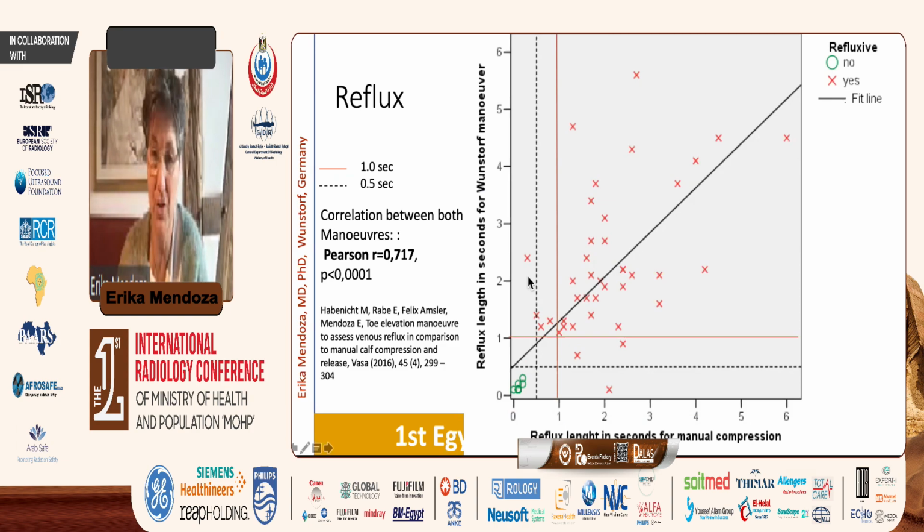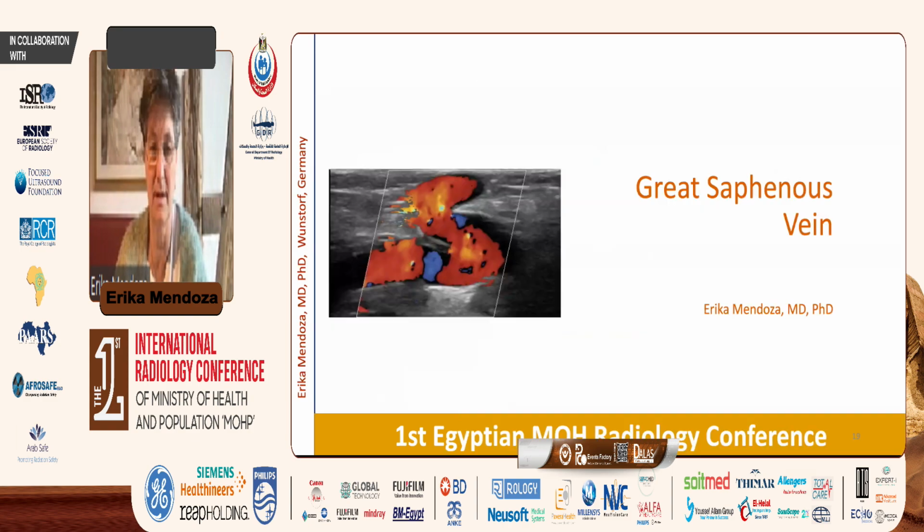So I would always recommend to use at least 2 maneuvers, those you prefer, knowing that you could do dependency in any case, and then evaluate the patient with at least 2. And for me, these cases were all not so ill. The really ill patients were these ones, and all those that had less than 1 second in one maneuver had also in the other maneuver more than 1 second. So for me, the cutoff to decide if the vein is really incompetent for the superficial leg veins is 1 second. And it is the same as the deep veins, which are also defined to be incompetent if the reflux is more than 1 second.